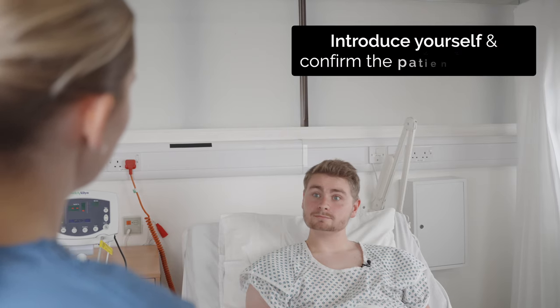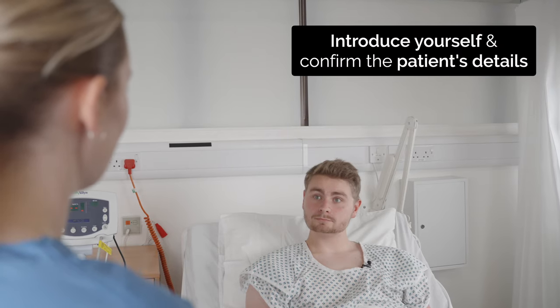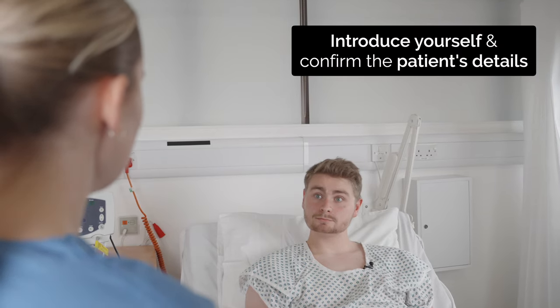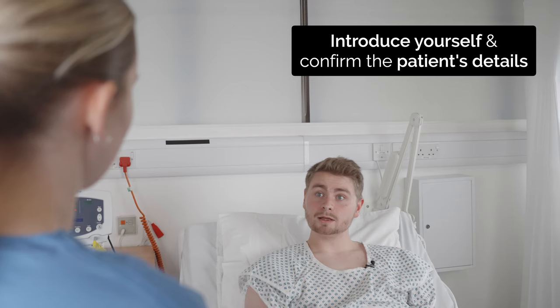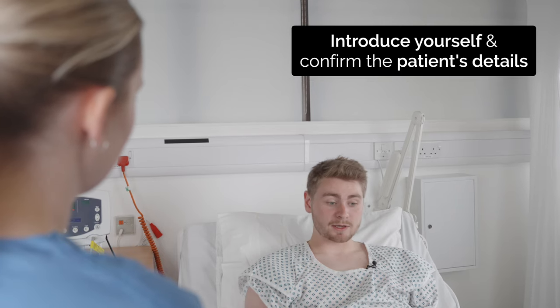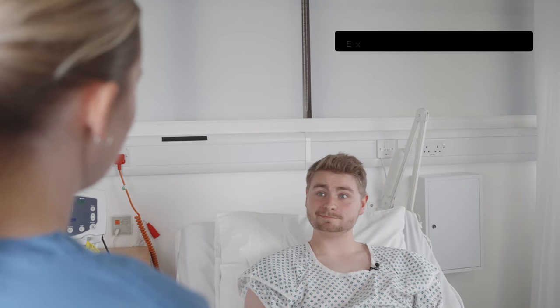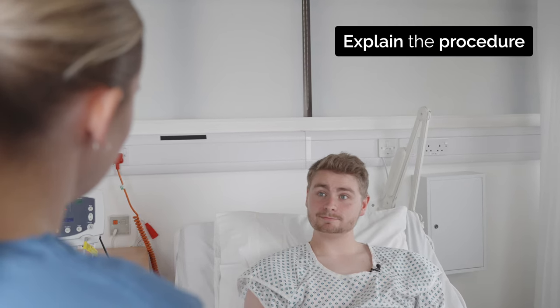Hi there, my name is Leah, I'm one of the junior doctors working on the ward today. Could I just check your full name and date of birth please? Yeah, Harry Miles, 21st of the 10th 1998. Thanks very much Harry.